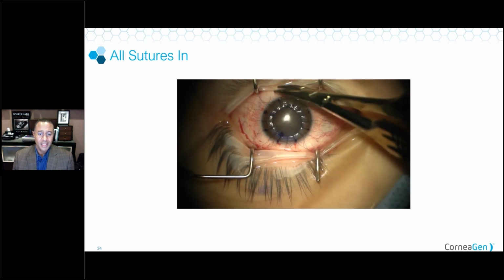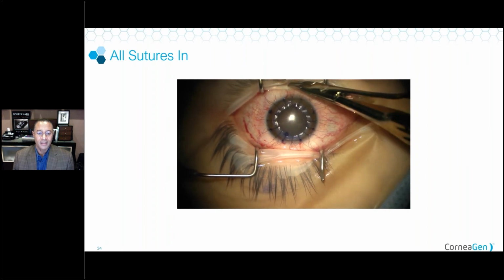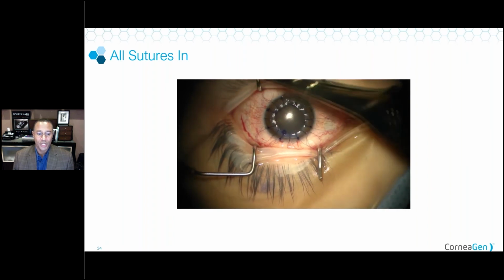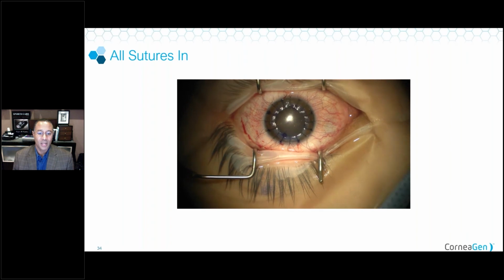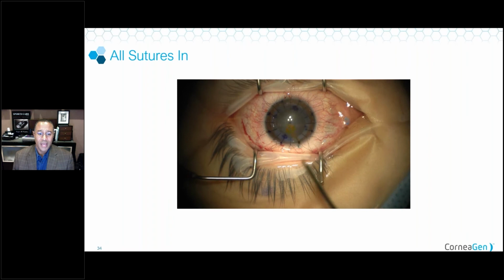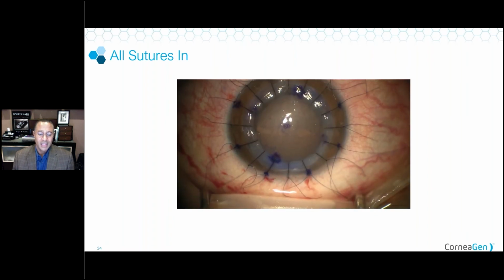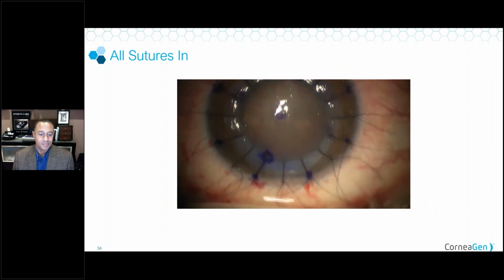Here's putting in the last suture. After I place sutures, I break them rather than cutting. Much, much faster. A little trick that not everyone does, but we tie the knot, we then rotate the knot, pull the knot to the edge, and then I snap the suture off, which keeps you moving very quickly. And then we alternate forehands, backhands.